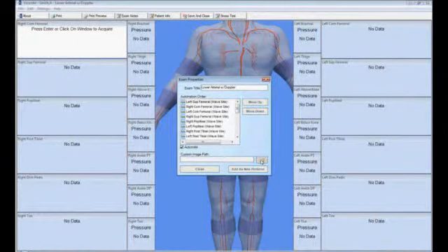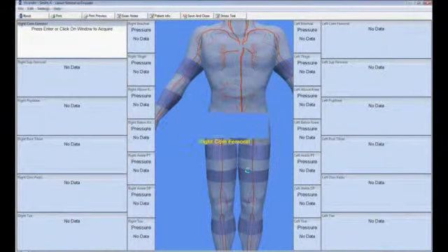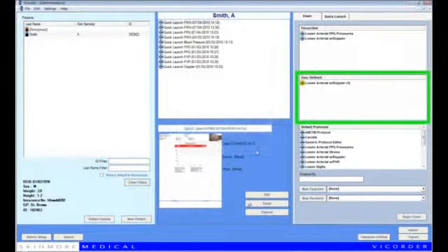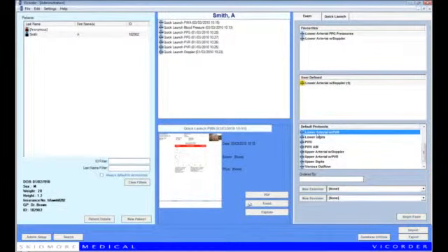By clicking on Add as New Protocol, your newly edited protocol will appear in the User-Defined Protocols box. The new protocol can be launched by clicking on it in the same way as the other protocols. We will begin our tour of the fixed protocols by launching the ABI/TBI protocol.